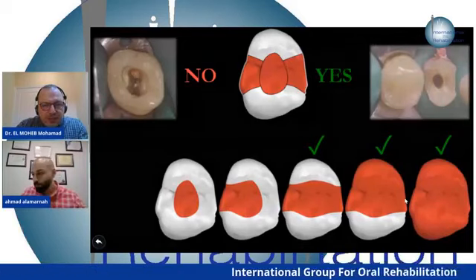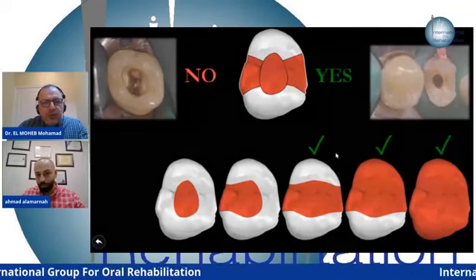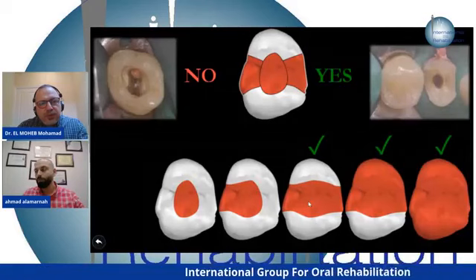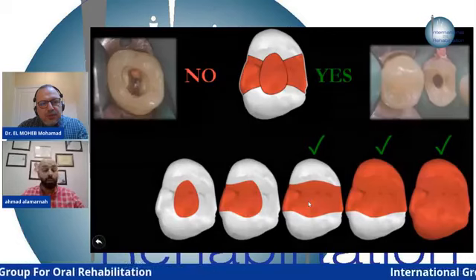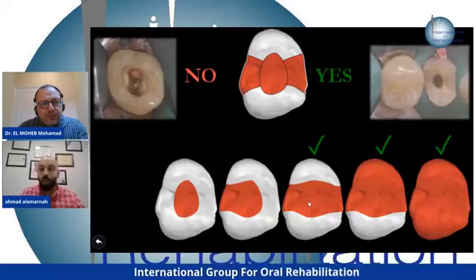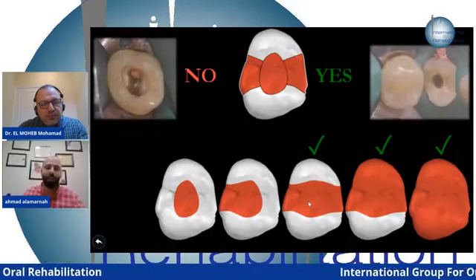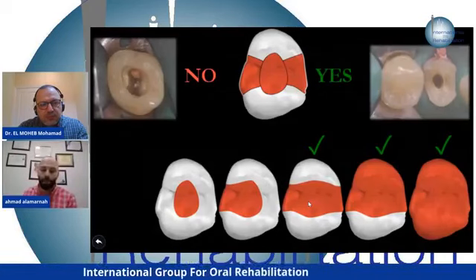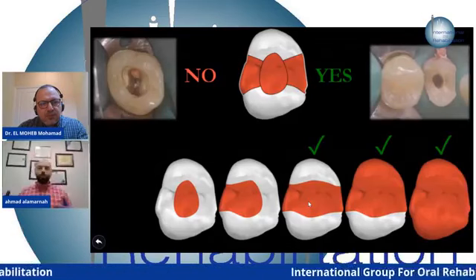Can I ask a question, please? The third case that you showed, the MOD, can we make, for example, an inlay only by CAD/CAM? Is it better than a composite restoration? Yes, you can. It's better because it's a controlled material. You did it outside the patient's mouth. You don't have the shrinkage, the stress buildup within the composite. So it's better.